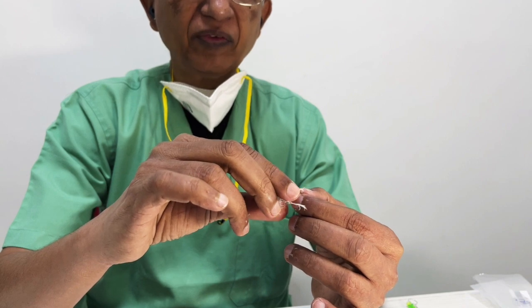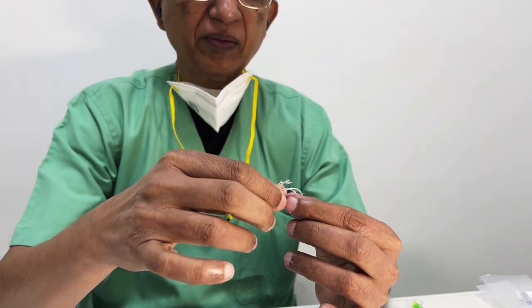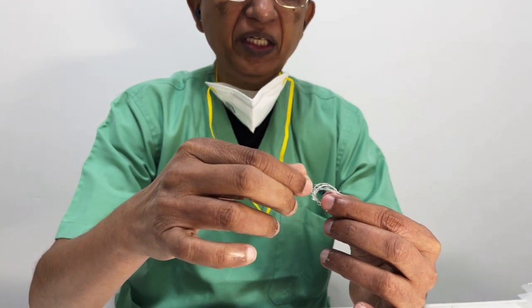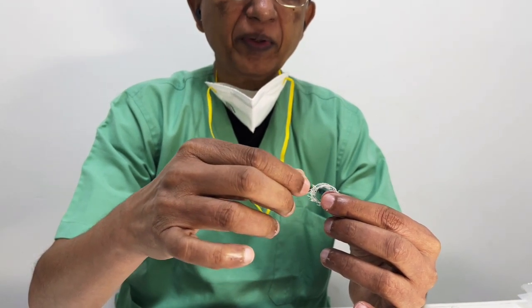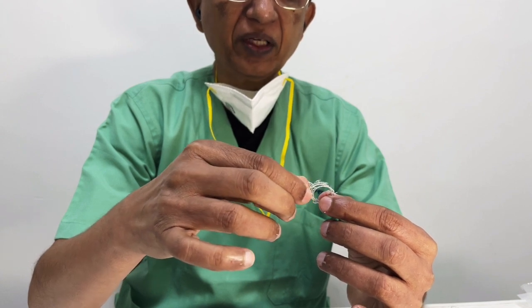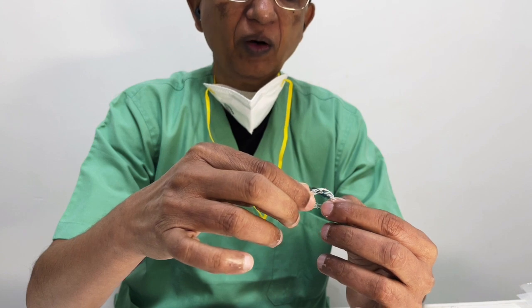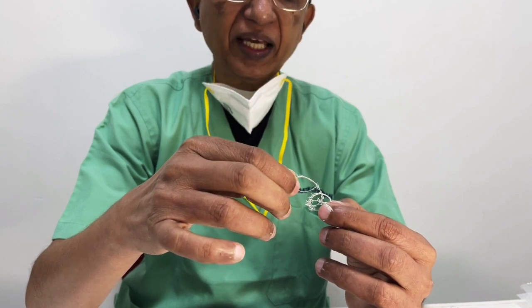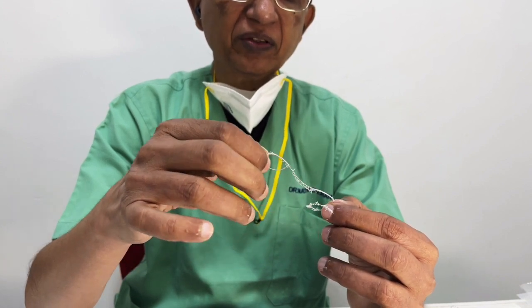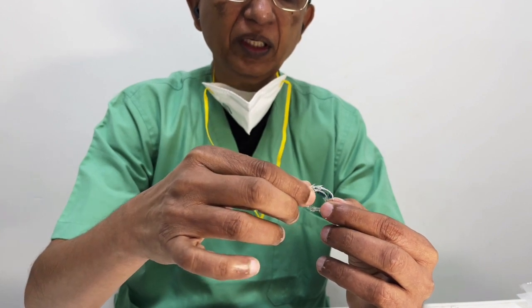Because of that, you cannot use it in intracranial aneurysms, especially when they are ruptured, because they will definitely induce a rupture. So the only place you can use it technically, if you want, is when you're trying to obliterate a CCF. Even there we find it's not great because of the stiffness. It tends to kick the catheter out. Okay, so you got it.